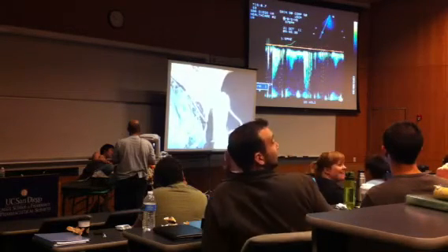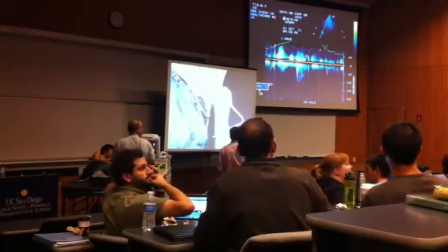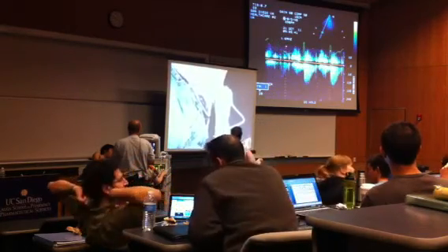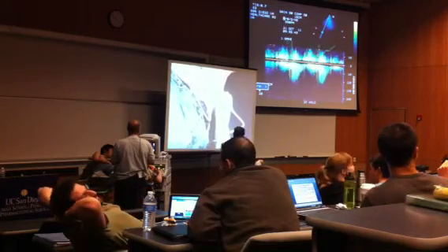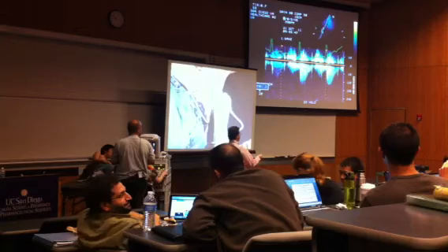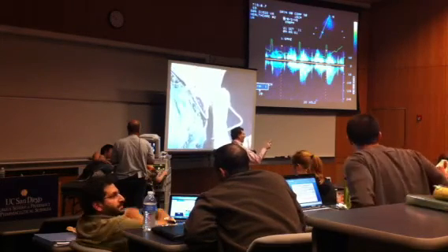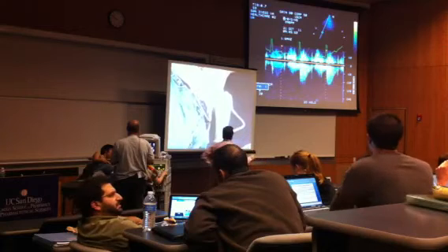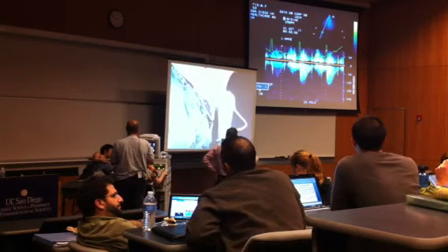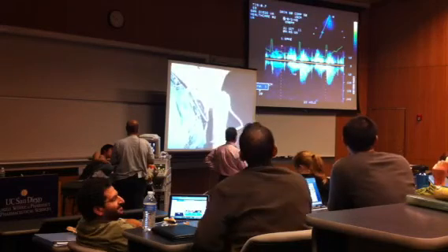Okay, so here we're measuring flow moving away from the transducer. Why don't you just stop it, Kelly? Perfect. We see flow out the aortic valve into the aorta itself. So what we're seeing is that here's our QRS complex. Systole has been initiated.